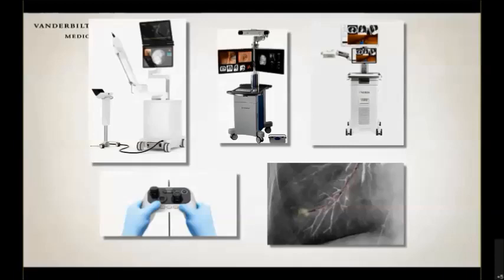The only issue with that is what Krish already mentioned: the problem with most of these technologies is that we have a very different bronchial tree and lung space than we had when the patient underwent the planning CT scan. We had a patient who took a big inspiration, full total lung capacity, and then all of a sudden we have a patient who was anesthetized on the operating room table, sometimes paralyzed with a breathing tube, and so things changed quite dramatically. It's really this adjustment between your planning CT and your procedure that becomes an issue.